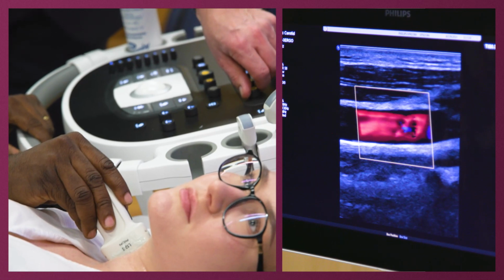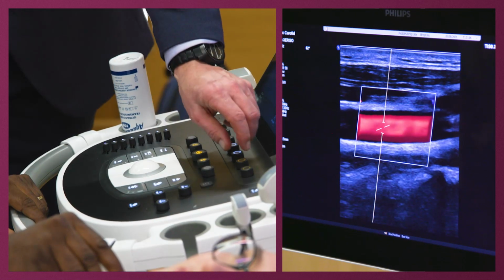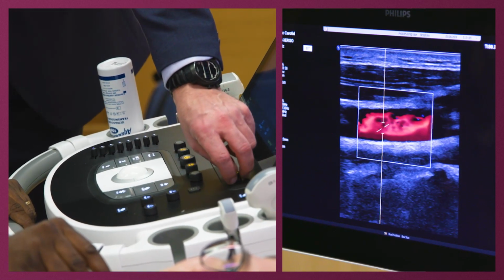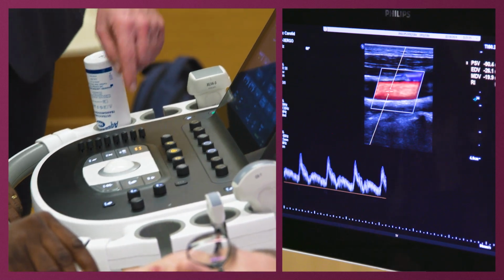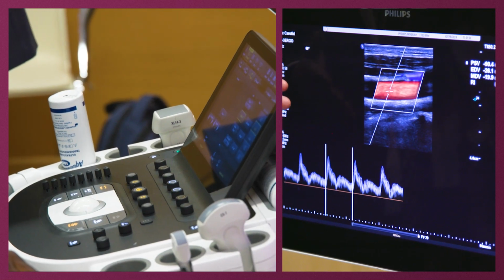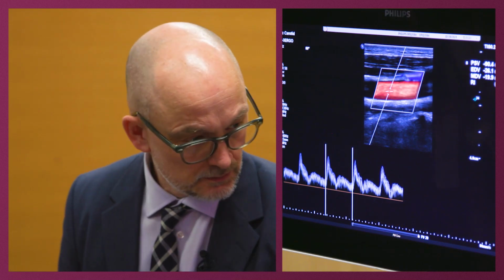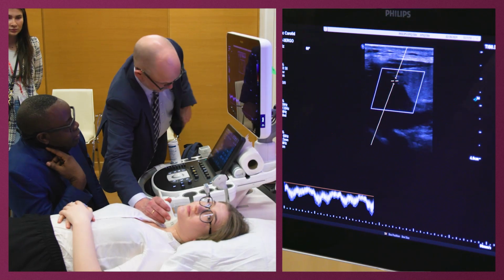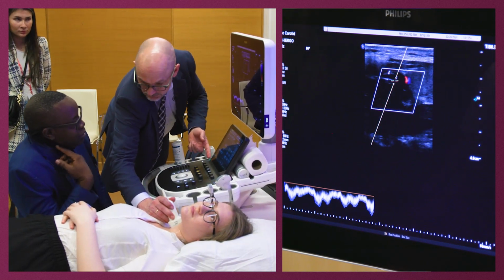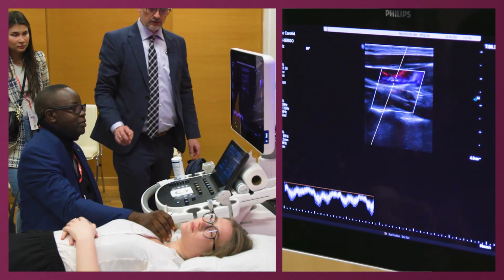I would adjust the steer a little bit in this direction, and then it's just for learning purposes, it's good to just look at this. You can see this is a mixed signal. It's both running to the brain and to the face, because it's a common. It's a good idea to put your hand on the patient like this, because then when you do something, it's much easier not to move your hand around. Okay, so it's fine. So you should put your hand on this, if you can, on the shoulder, and then relax.